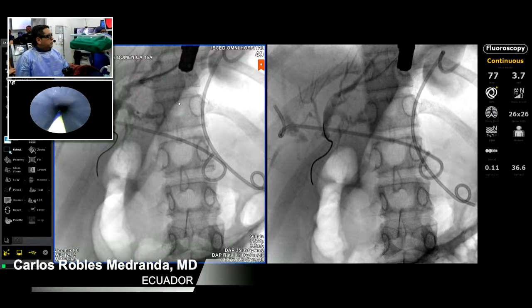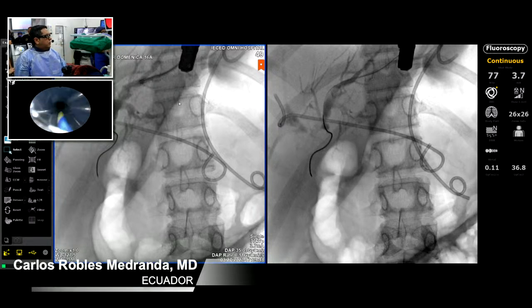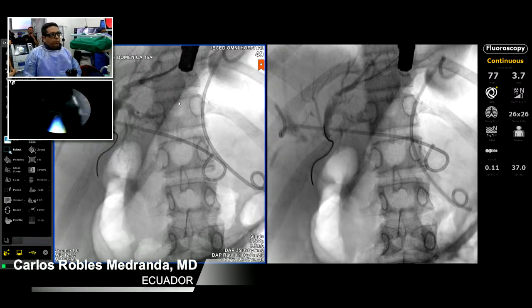So my concern is that I don't see the air. There, you see? For the moment, I arrive to see that we have a communication, and then we can deal with this.